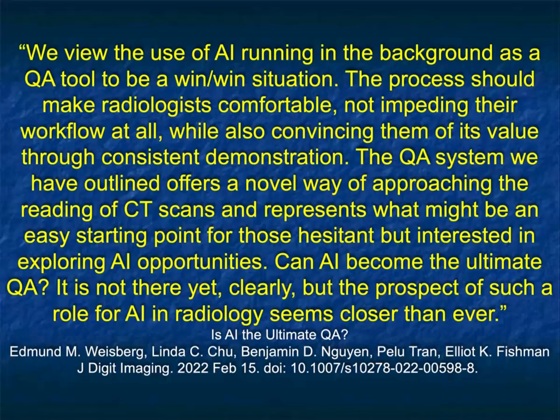The processing is running in the background. They've had articles where they've shown that if you look at this for lung nodules, they picked up many missed lung nodules. Again, the radiologist was not perfect. I guess in the long run, this is a way of doing things. The challenge, of course, is that you need a third party at the end to look at the reports and look at the images when there's discrepancies. So there takes more work there. But again, it's a way of thinking about things a little bit differently.